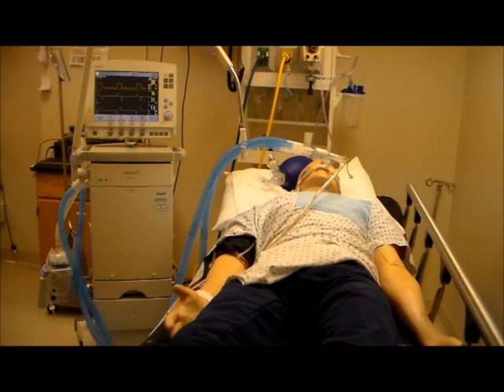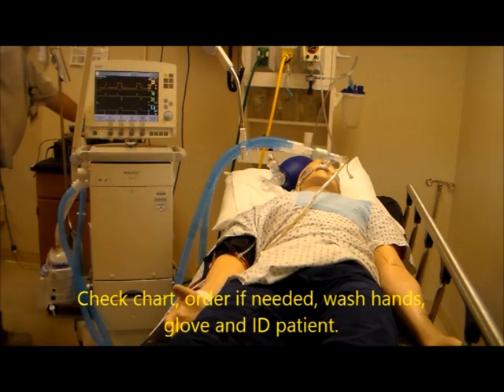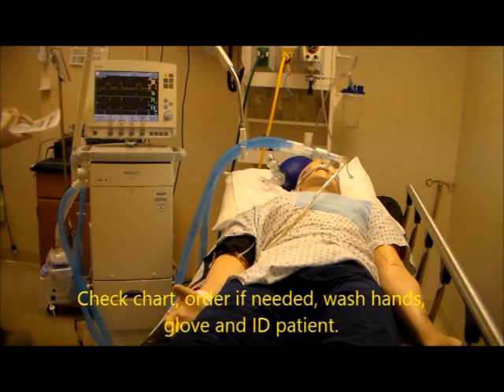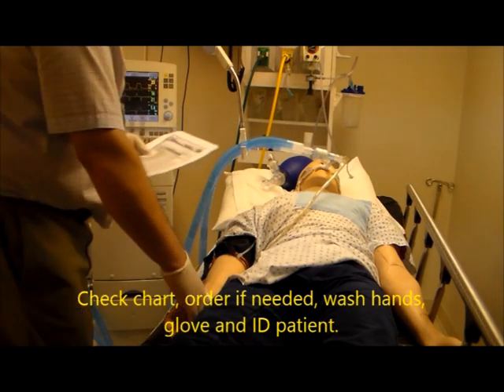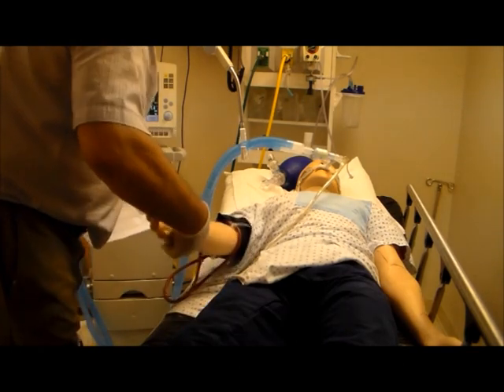Today we're going to be doing weaning parameters through the Servo-i. What you want to do before you come into the room is check your chart for the order, check your patient's history, put gloves on, and come in and identify your patient.